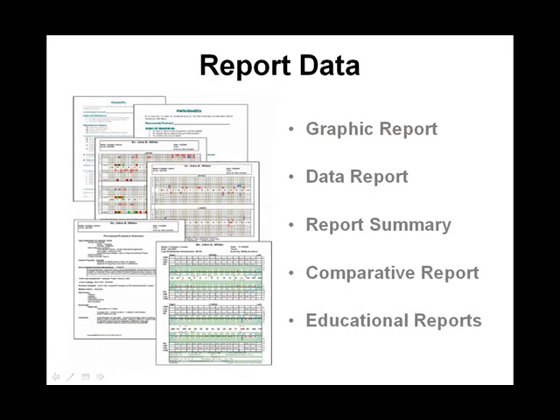The verbal recording of a periodontal exam, combined with real-time viewing of charting data, provides patients with visual and tangible evidence of their periodontal health, disease, and needs. After the exam, the patient's current exam data is generated into 4 PDF reports, displaying a clear and concise diagnosis. Educational documentation is also available.